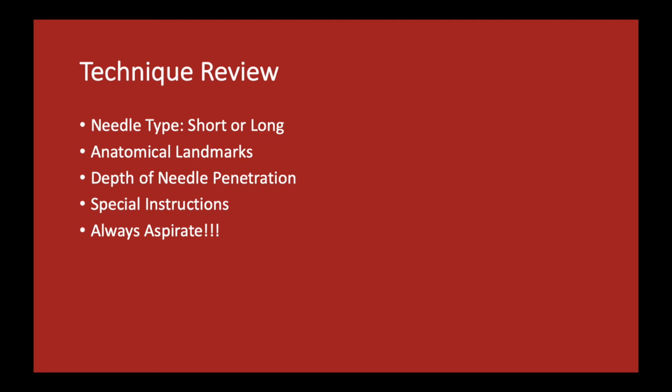Each technique will include a brief summary, including the type of needle that should be used, the associated anatomical landmarks, the recommended depth of needle penetration, and any other special instructions. And remember, it's important to aspirate before every injection to ensure safe needle placement. Let's go ahead and get started.